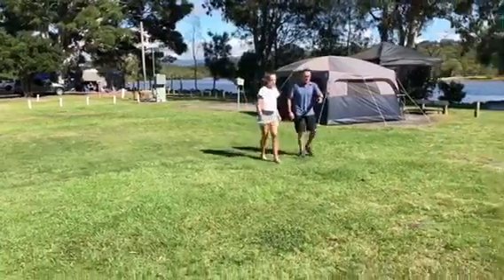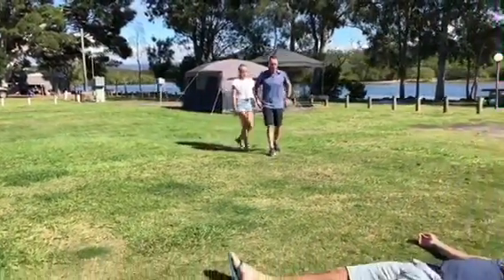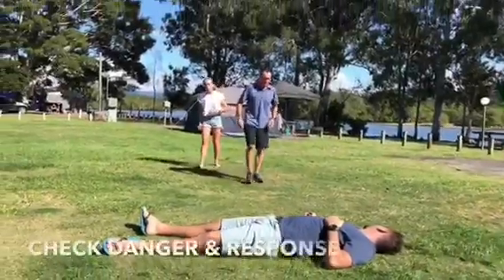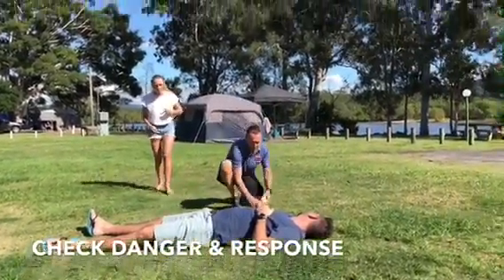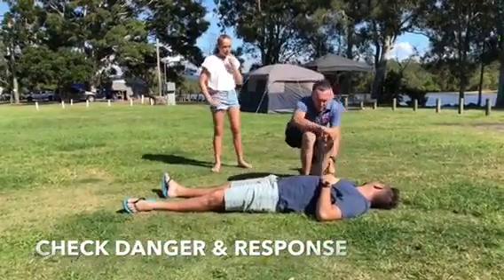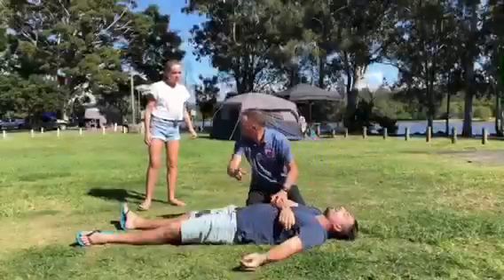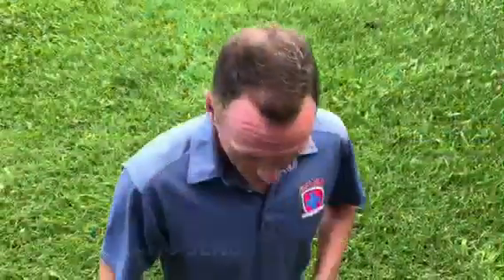When approaching any first aid situation, it's important to remember to check for danger. Ensure there's no electricity or anything that may harm you or the patient. Once you have done this, you can now check for a response from your patient. Ask them to talk or open their eyes, or get them to squeeze your hand. If your patient is unresponsive or injured in any way, now is the time to send for help.